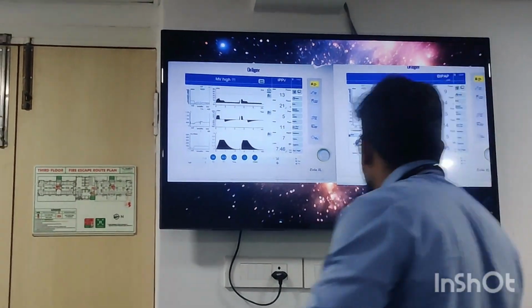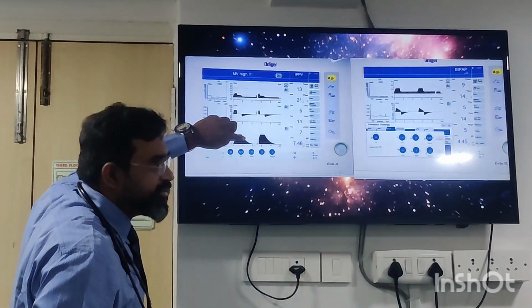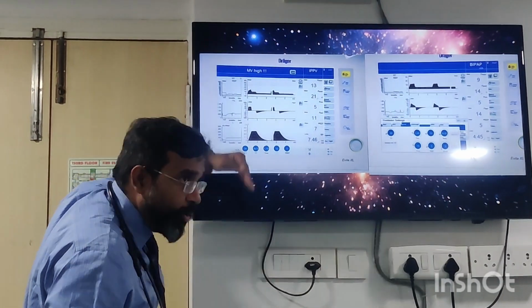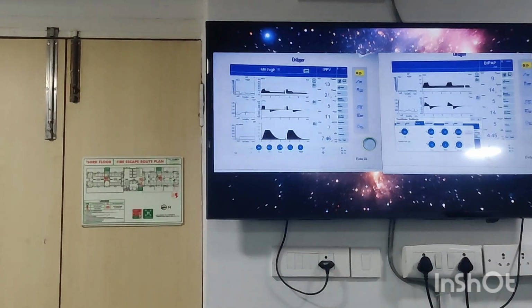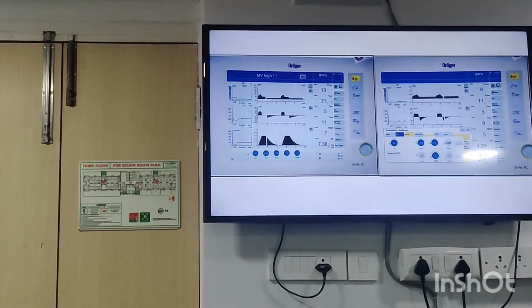So in short, if you want to really understand what cycling is going on, you have to plot this part. That's why I put that line there. If you plot this part, where the expiration downward is starting, that is where your expiratory phase is starting, or cycling is occurring. Clear? That's the difference. All right.